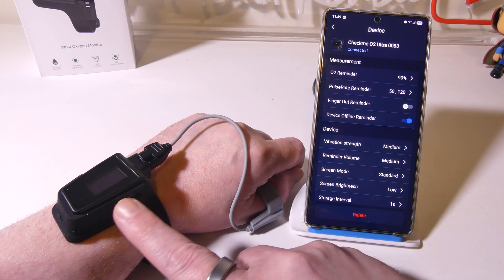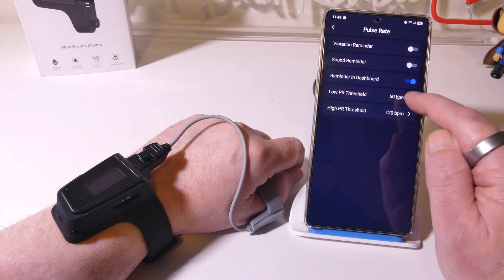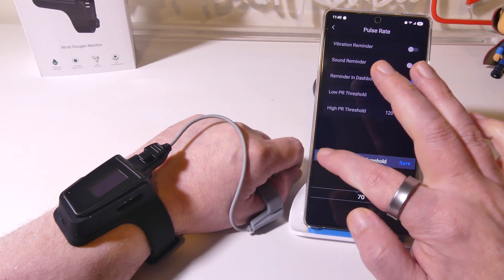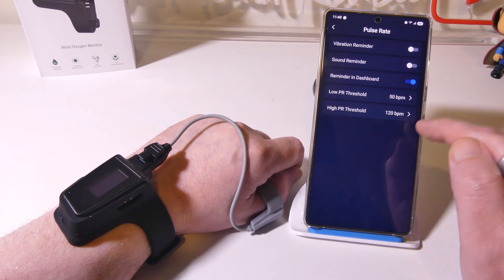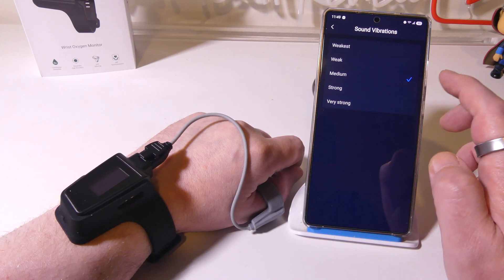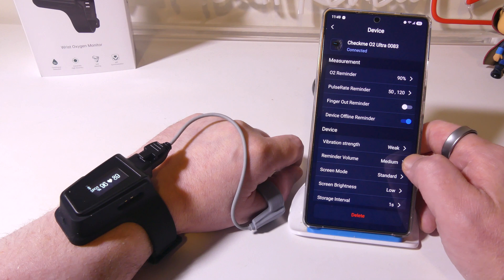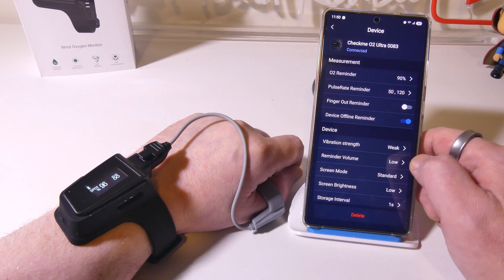You can also set the pulse rate upper and lower thresholds. The low pulse rate threshold is 50 out of the box, but you can set it all the way up to 70 or all the way down to 30. The high pulse rate is 120, but you can set it all the way to 200 or 270 beats per minute. You can set your vibration strength: weakest, weak, medium, or strong. On medium — the default setting — it is pretty strong. If I was wearing this overnight, I believe even the medium setting would wake me up. The lower setting will extend battery life, but with 100 hours of battery life you're not going to have a problem getting through several nights.